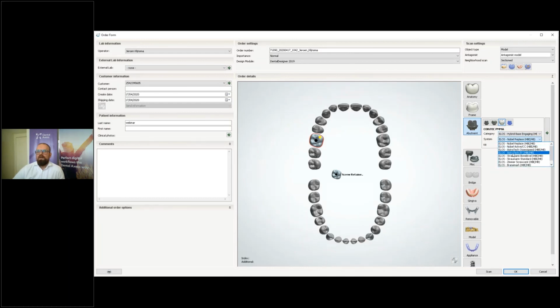I select the brand and the type, and then I select the type again. Here, do I still have a model analog in stock? For some brands we still have one or two model analogs, but the rest is going to be all printed model analogs. So if you're going to design a model, you need to be sure what you want to use.